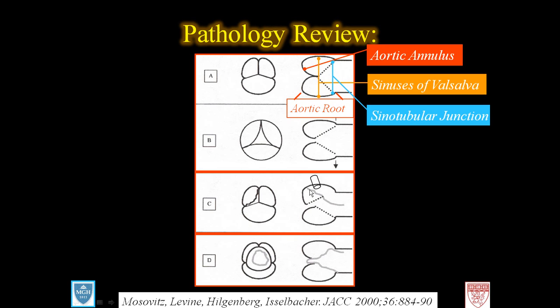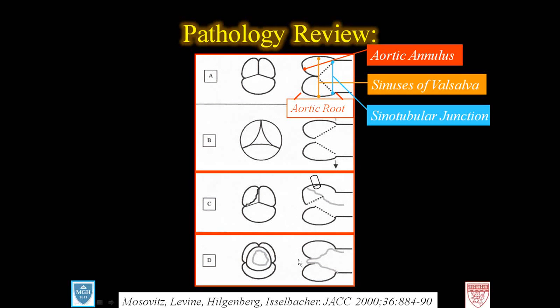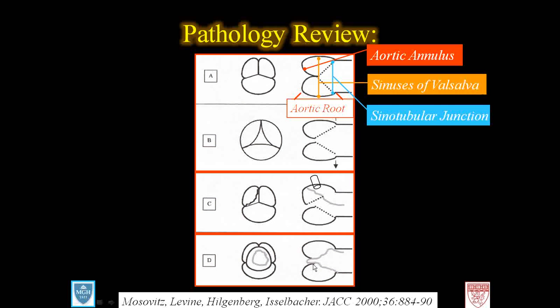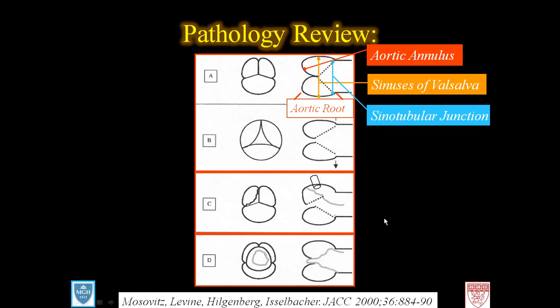And you can see here the aortic dissection flap has come down into the left coronary sinus, and you can see the left coronary artery drawn in here, and undermine the function of the aortic valve, causing eccentric aortic insufficiency. Aortic dissection flaps can also prolapse in and out of the coaptation point, often not causing a huge amount of insufficiency, but nonetheless they need to be repaired. The ascending aorta, when it's replaced, which is how this is fixed, will alleviate this problem, and the aortic valve does not need to be replaced in either case if these are repaired correctly.